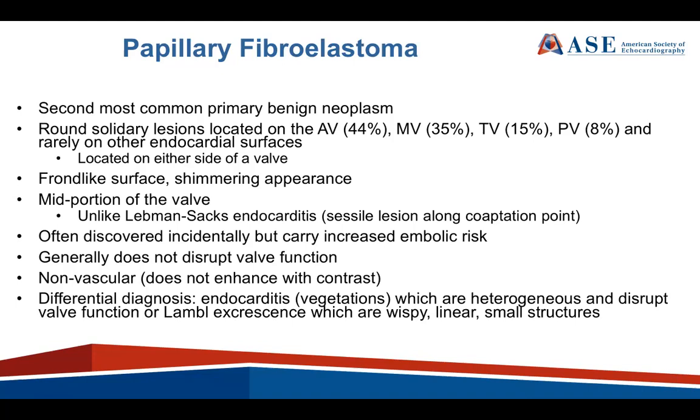Again, these are often discovered incidentally, but they do carry an increased embolic risk. And so occasionally we will identify this in a patient who had a stroke, and we then have to suspect that this is the etiology, especially if it's on the left side of the heart. They generally don't disrupt valvular function like myxomas because they don't cause obstruction. And again, they're non-vascular, so they will not enhance with contrast.